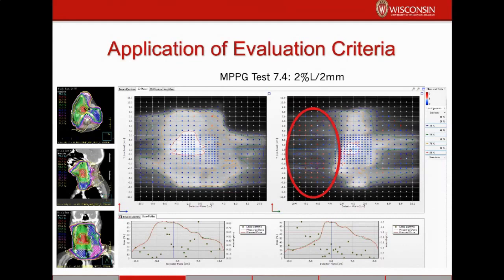The way we do it at UW is generally we start with film and ion chamber, and we measure kind of a small set of really, really difficult plans with those and get the model looking really, really good for those. And then we measure a much larger set of plans using patient-specific QA devices just to check our work, so to speak. And so we use some of the more labor-intensive methods to get started, and then we cap it off with patient-specific QA.